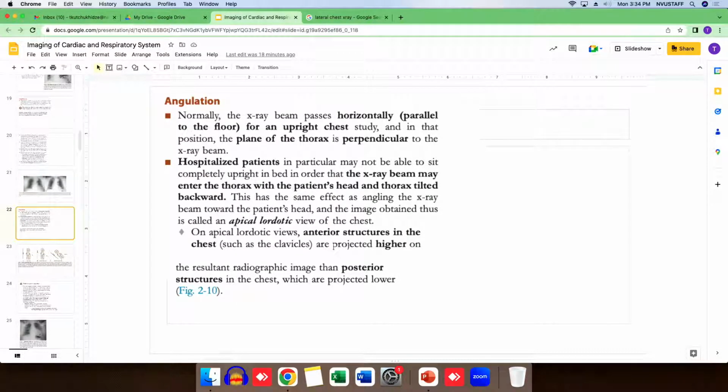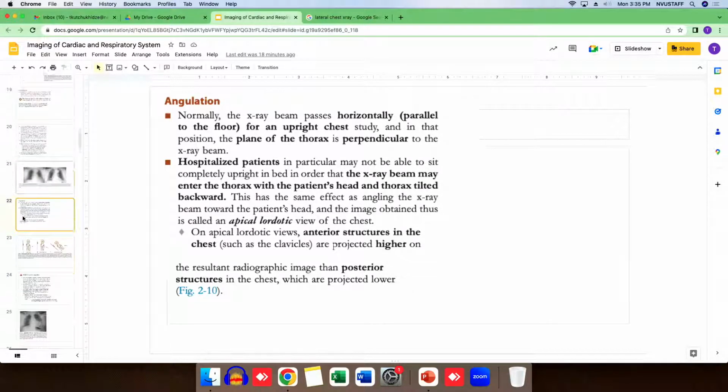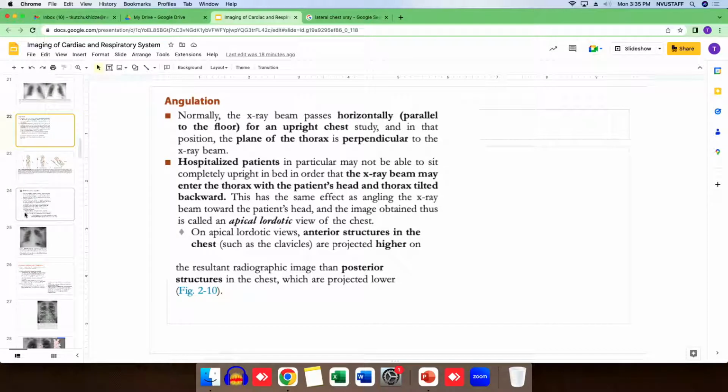And angulation is one of our final parts that we check when taking the photo. Angulation means how our clavicles are located and where they are located, for example. And also we check whether our thorax is located in a perpendicular or horizontal plane, because we have changes, like rotation, on our X-ray.